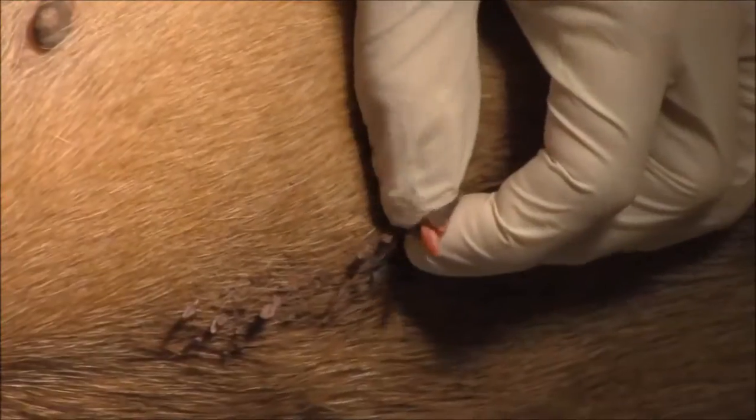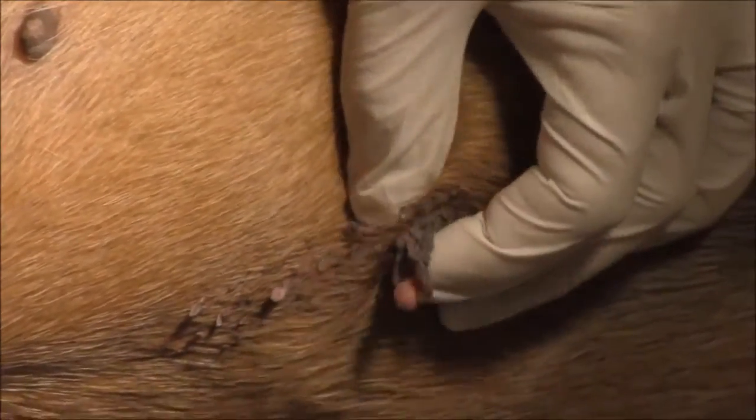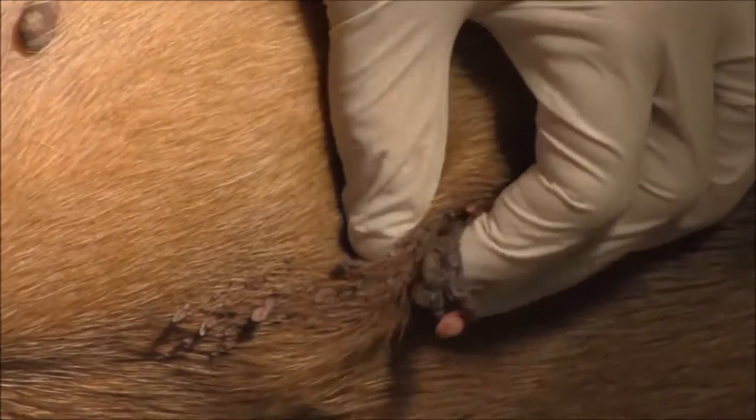I want to show you how this unit can help take these off quickly, efficiently, and really with not a lot of pain for a dog like Angus. Now he's barely sedated today just for this demonstration, but you can do this on dogs that are not sedated.